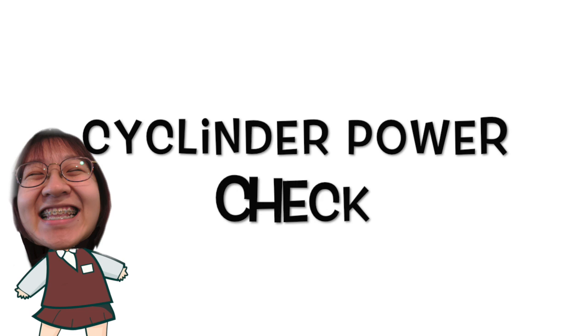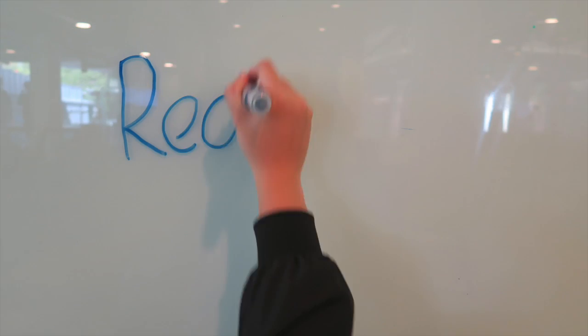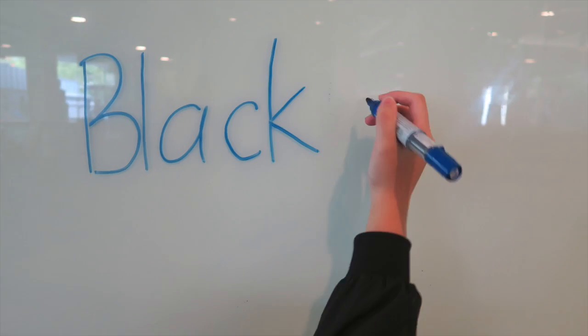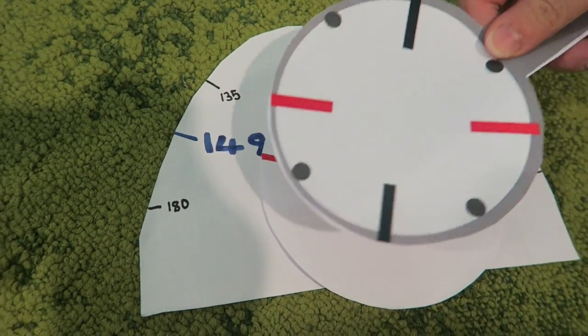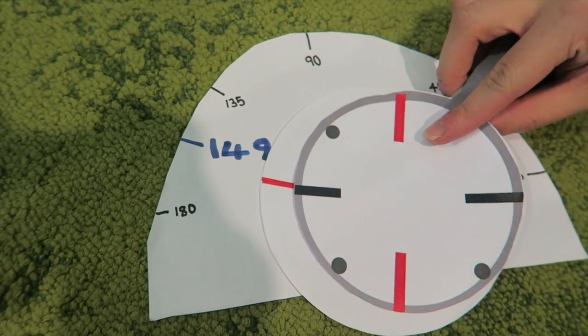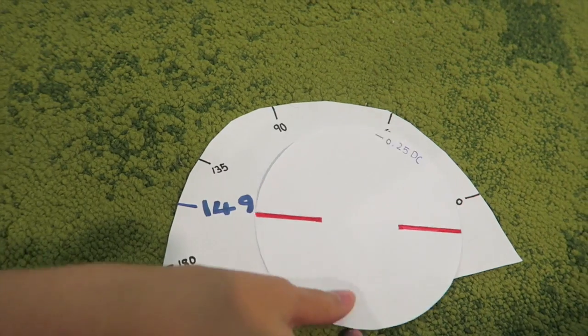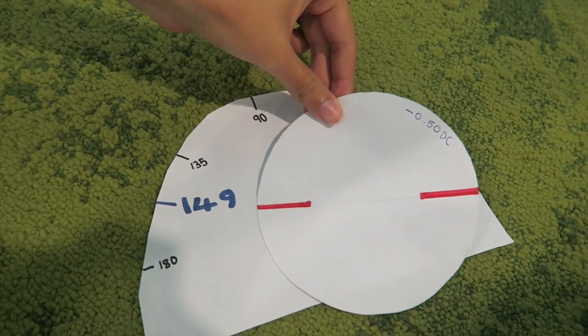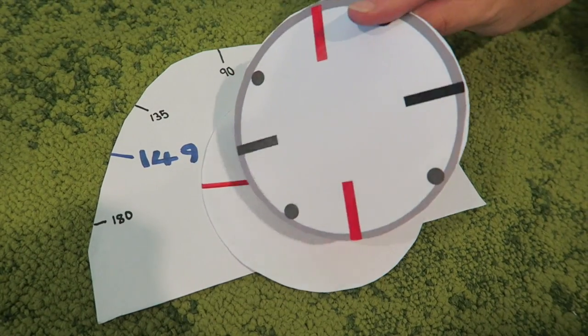For power check, align the line on the JCC to the cylinder lens axis. In this case, if the patient prefers the red line, therefore add minus 0.25 DC. Repeat the same instructions to the patient.